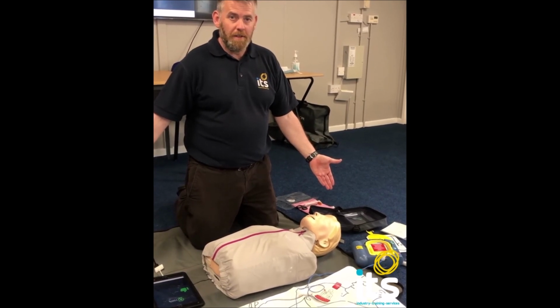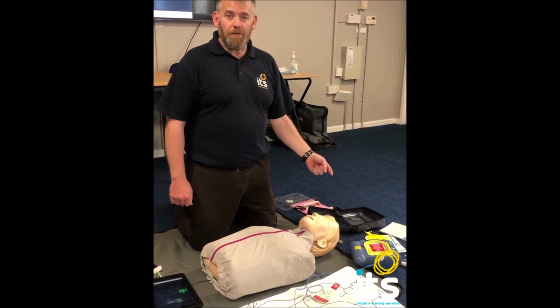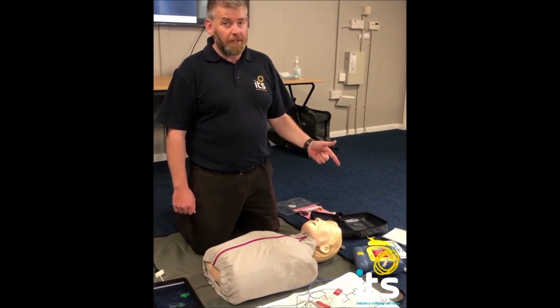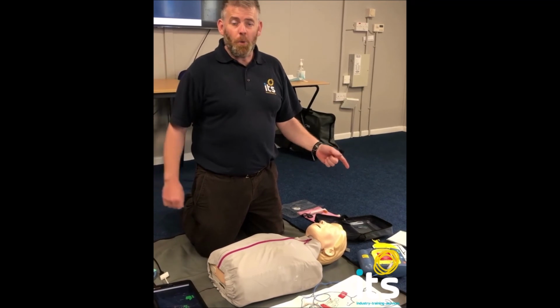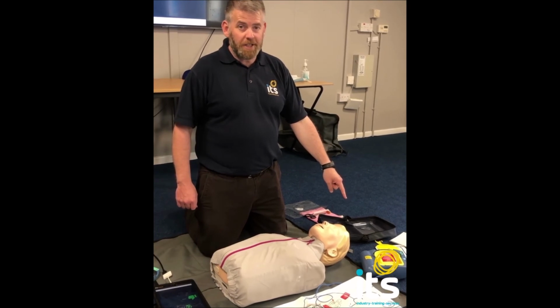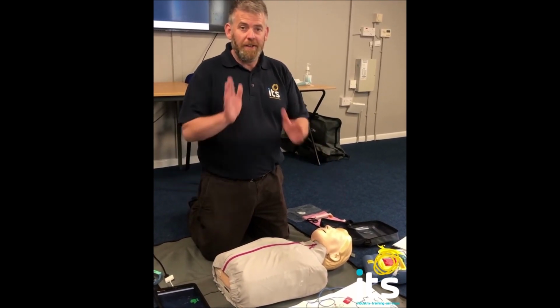If needed, start CPR. The machine has just said to you, shock's not advised. That's because the machine is seeing one of two things. It's either seeing a normal heart rhythm, electrical tracing, or it's seeing flatline, which is dead. But the machine doesn't know what. So when it's telling you it's safe to touch the patient, start CPR if needed.